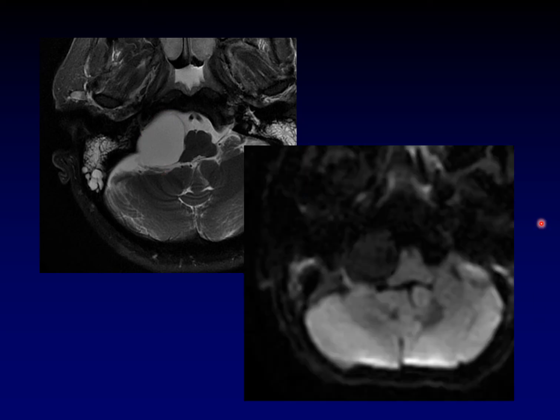Another example in the differential of epidermoid tumor and arachnoid cyst, here is a lesion that has a well-defined margin. It is bright on T2, same as CSF. It's in the cerebellopontine angle cistern, displacing the cerebellum and the brainstem. Well marginated, nicely defined rim. That's a clue, maybe. But the diffusion weighted image is going to really clinch it for us. Facilitated diffusion, there's another arachnoid cyst.